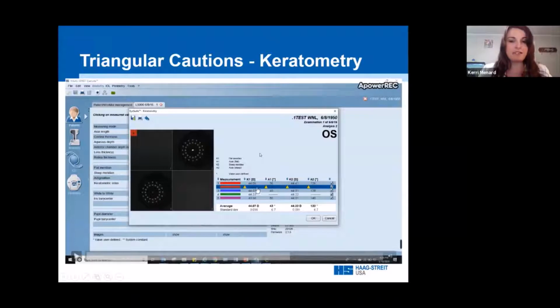And when we compare these measurements to the 4 remaining measurements, they're very consistent. Our standard deviations are extremely low and less than the guidelines. So would we have to delete and remeasure this scan if we were measuring our patient? No, not in this case, okay?